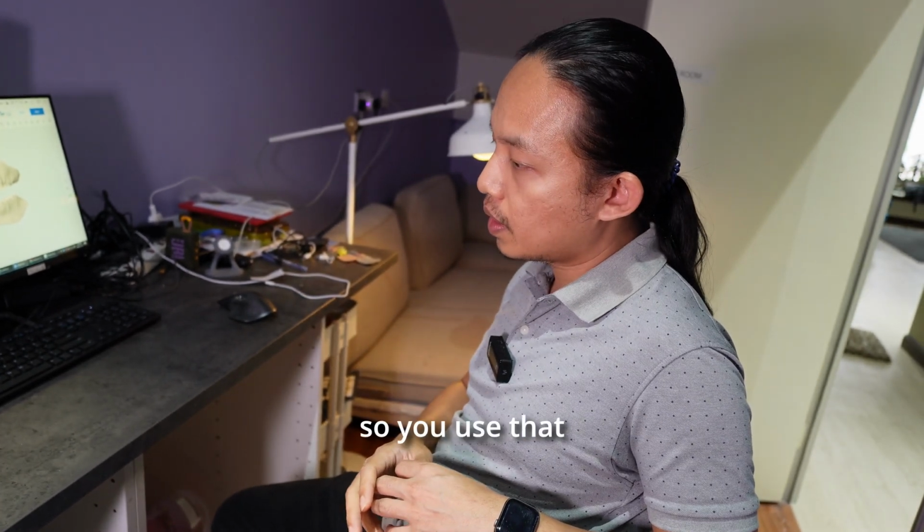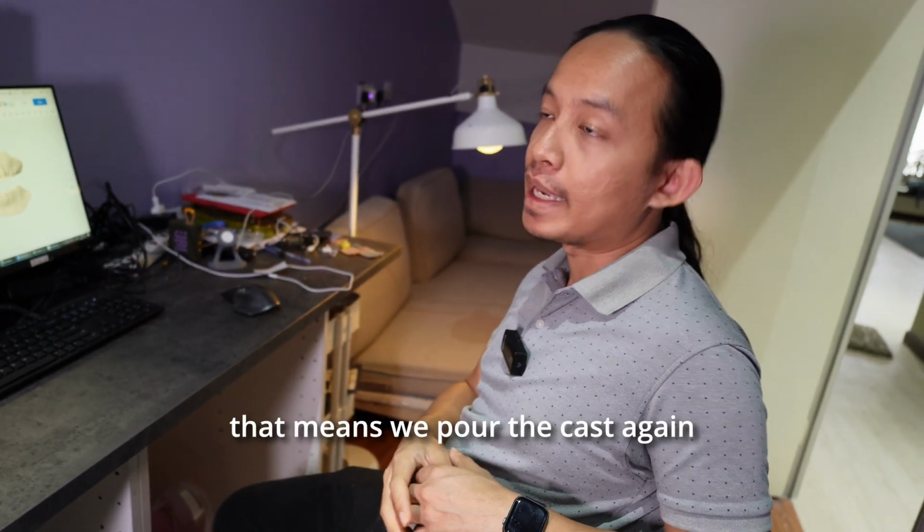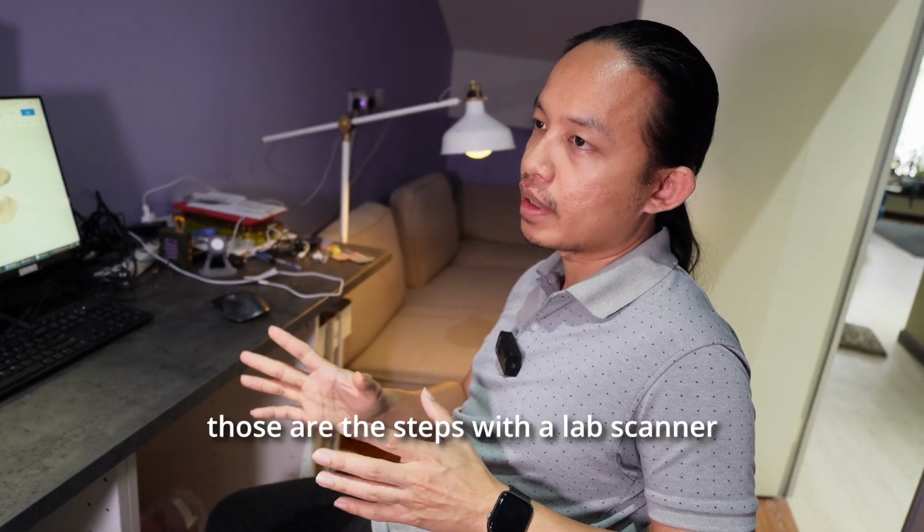Alright, so you use that, do border molding, take another impression, then you scan. It means we pour the cast again. Yeah, so pour the cast again. So those are the steps with a lab scanner.